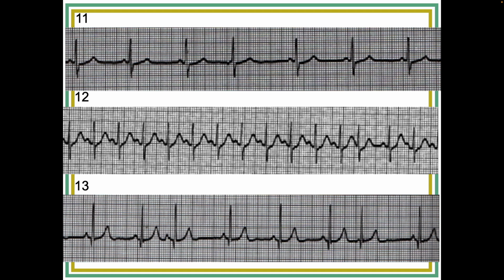Which one? The R to R interval is long on this one. So from here to here? Yeah, compared to the rest. What about this one?